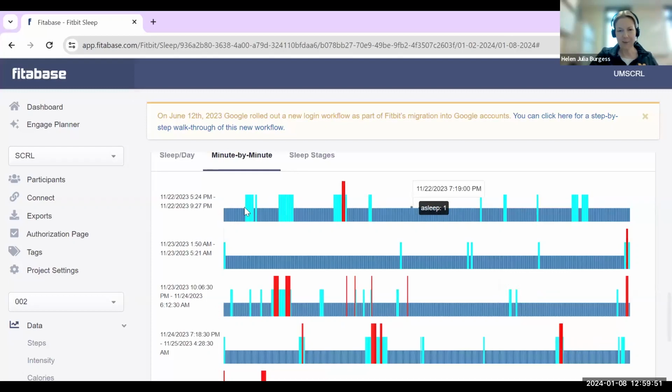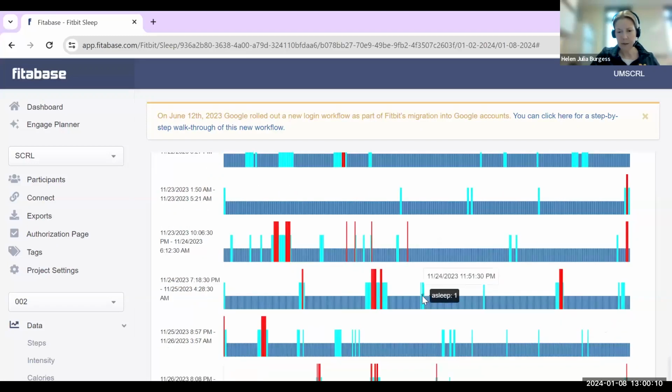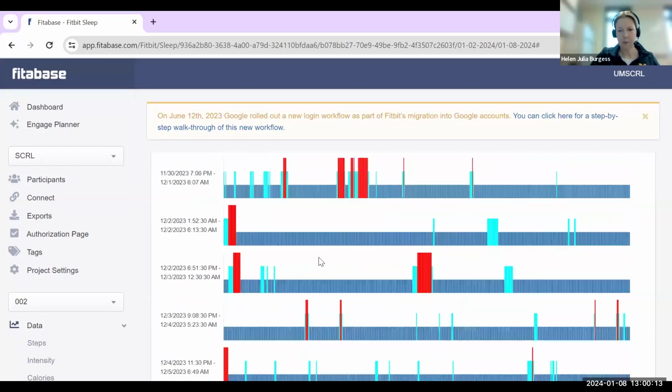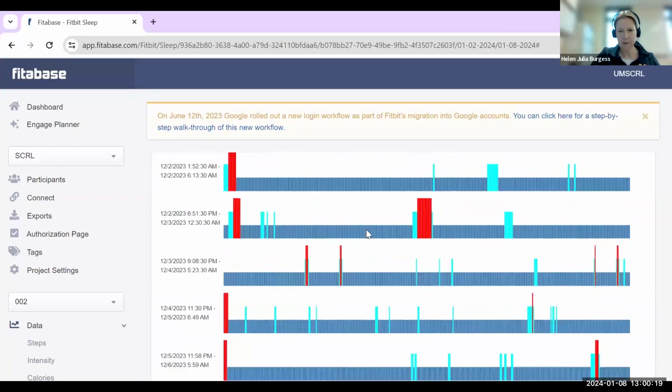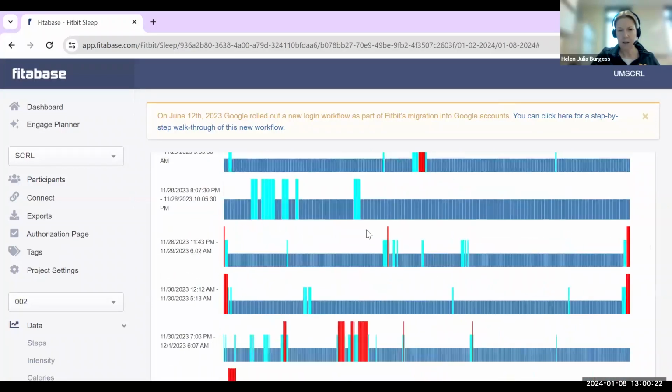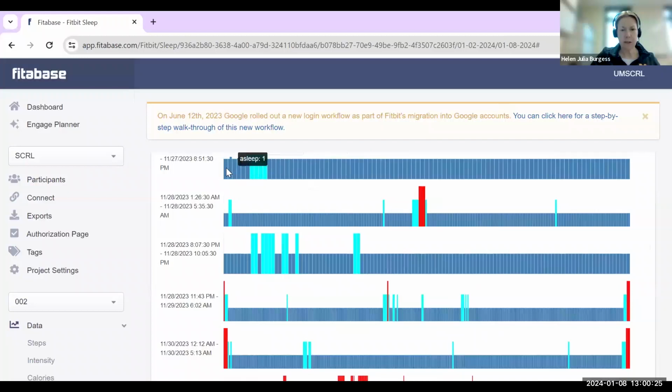And it took me a while to appreciate this. While over here, you can see the start and end. So this is a nap that's showing up here. And then nighttime sleep episodes: the entire episode is stretched across this same width on the display. So that's just helpful if I scroll down here. Sorry, I think Zoom is really slowing down my view here. So here, for example, you can see the epochs, again, still 1 minute epochs, but they're a lot wider. And very quickly, you can be like, okay, well, that's probably a nap. You can see it straight away because of the display.